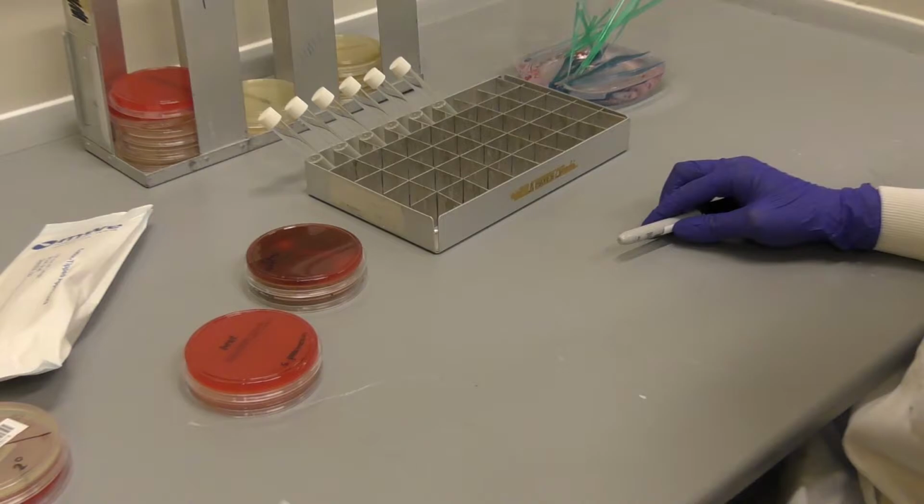You'll be using 2 different types of agar to set up sensitivity testing. For the Streptococcus pneumoniae, you'll be using Mueller-Hinton agar with 5% defibrinated horse blood and 20 milligrams of beta-NAD. For E. coli, you'll be using Mueller-Hinton. It's crucial to use the correct agar and incubation conditions and times when undertaking E-test testing, as over or under incubation can impact on the accuracy of the readings.